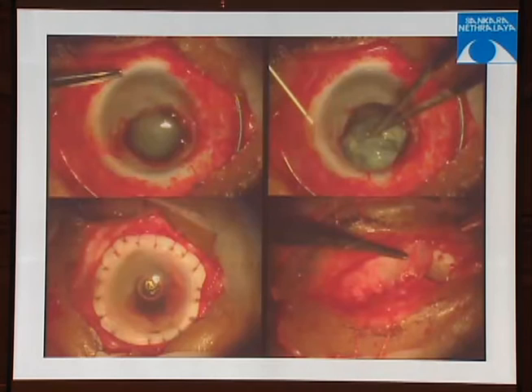This is a patient, again, who presented in the acute stage with a corneal melt. The peripheral cornea was thinned out and spongy. There was a perforation. The lens was protruding out. We removed the lens. We did a large tectonic lamellar graft and did a conjunctival hooding. The intraocular pressure spiked significantly. We had to do an Ahmed glaucoma valve.